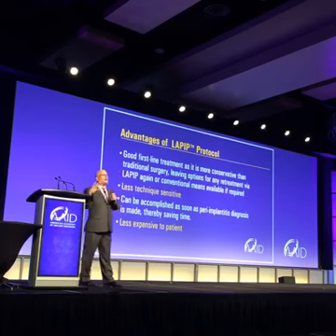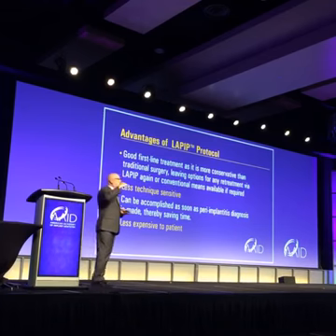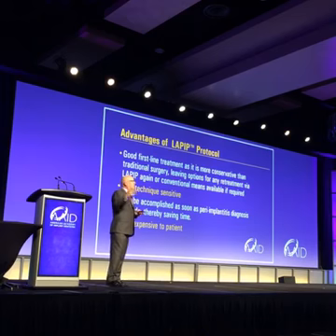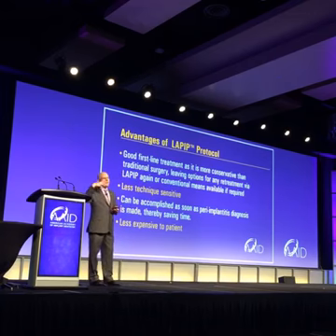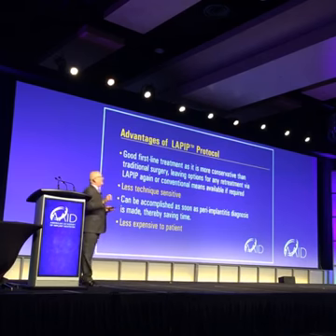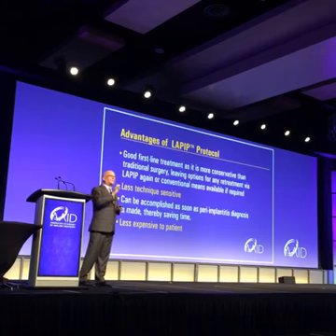And if you add in all the things that you want to do to the patient, like I said, if you add in everything to do a peri-implantitis case, bone graft, membrane, biomimetic, BMP, whatever you want to add in, PRP, whatever, it adds a cost to the patient. This is probably the least expensive option to the patient, and I think it gives some of the most, what's the word I'm looking for? I'm having a little brain thing. Most consistent results I've seen. If I don't see the results that I'm looking for, I know there's something wrong, and I can go in and retreat or figure out what's wrong with the implant.